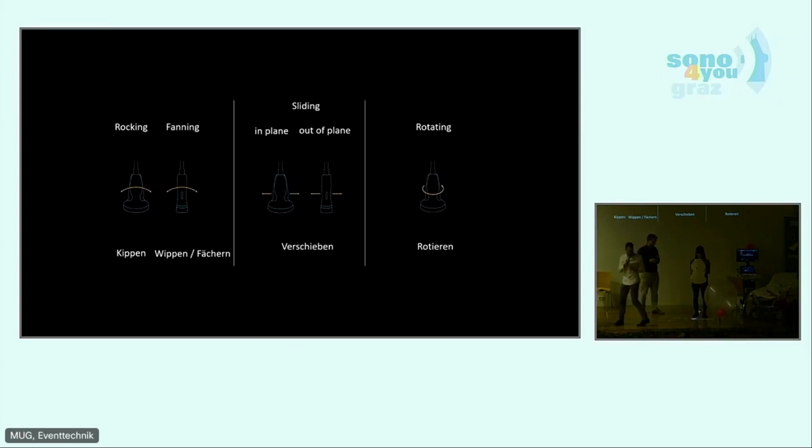Okay, Jana. Would you please follow my instructions? So hold the probe a little bit higher, please. Yeah, like that, it's great. So now I ask you to do a slide in plane to the left side. Okay, make a step to the left side. Okay, a little bit back with the probe. Like to the right side. Yeah, there we are.